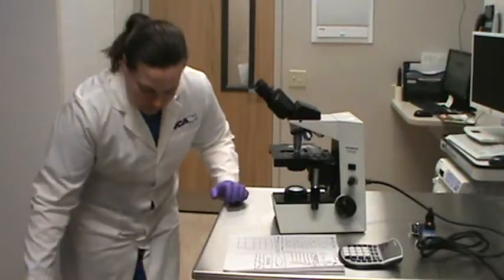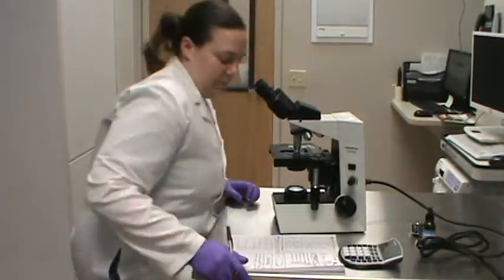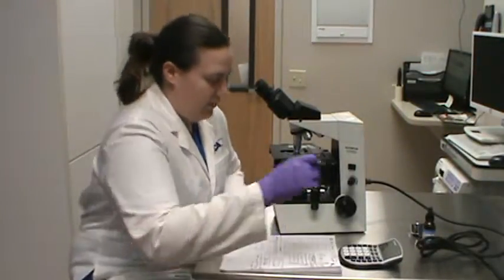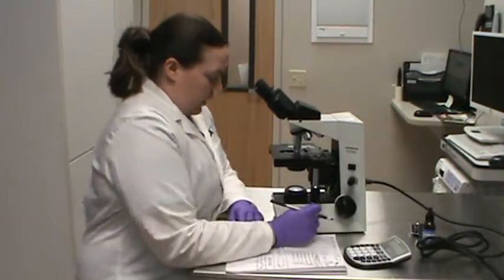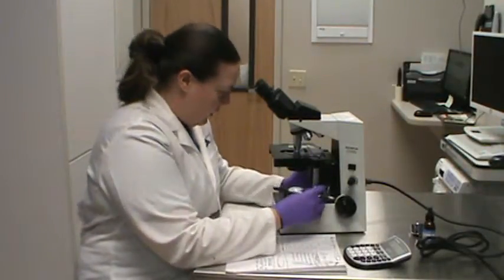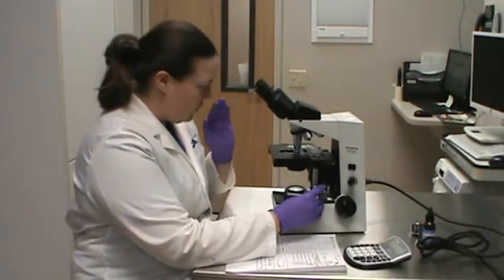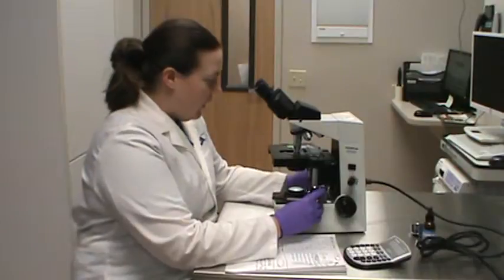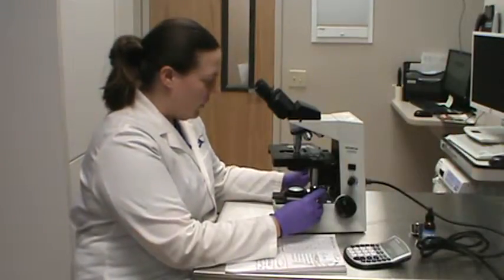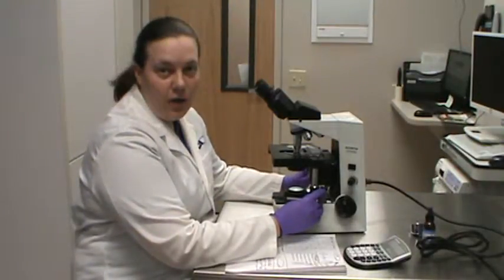so come on over here. We're going to have a seat. All right, so again, this is on our 100 times power lens, which is our oil immersion lens, and we're going to start counting 10 different fields and counting our platelets.